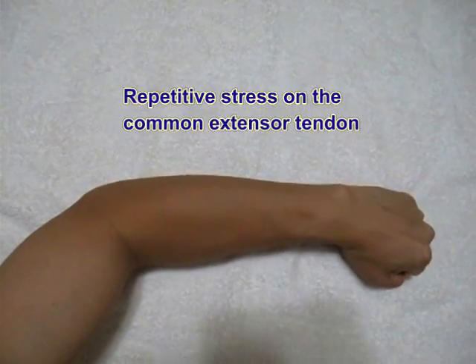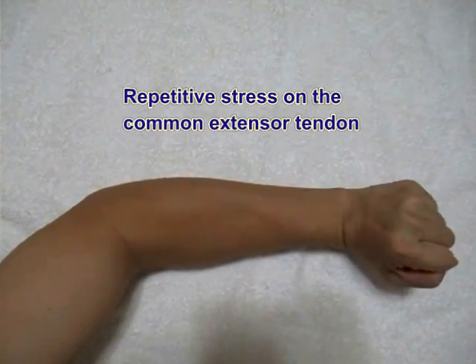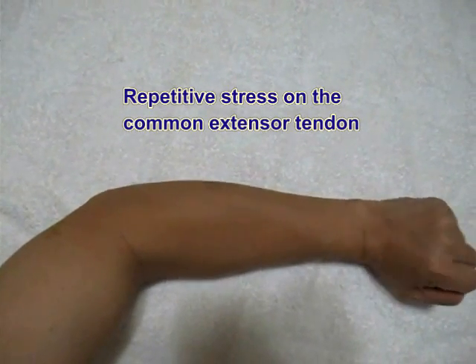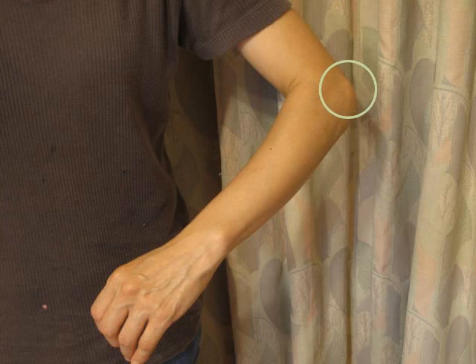The cause of tennis elbow is usually repetitive force on the common extensor tendon around its attachment to the lateral humeral epicondyle. Diagnosis of tennis elbow is usually made clinically without image proof. However, there are actually many different pathologies that can be seen under ultrasound.